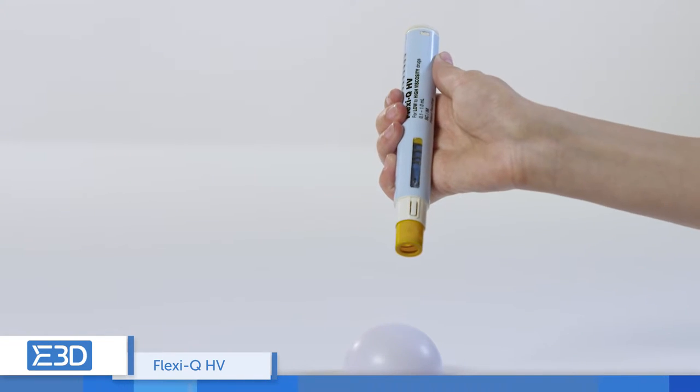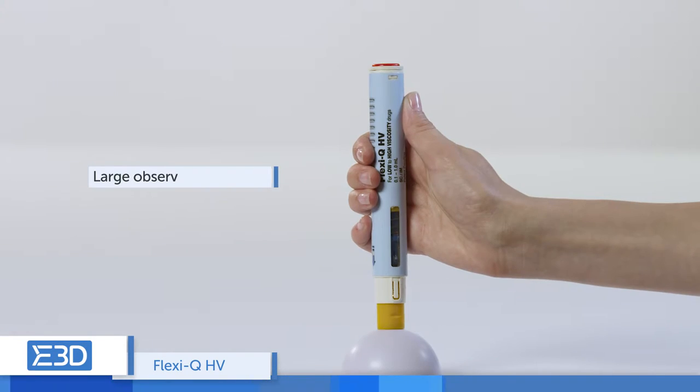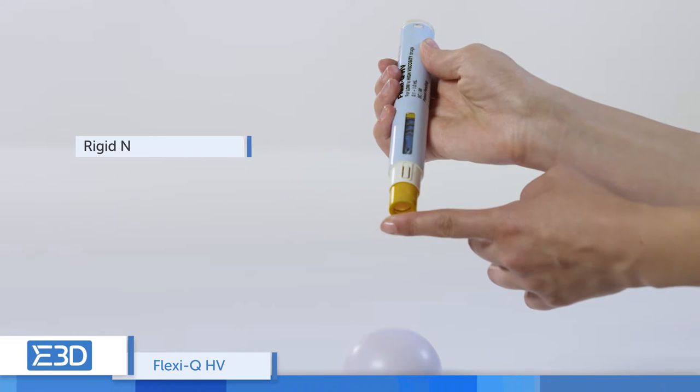The FlexiQ-HV improves patient safety and compliance with a simple inject button, a large observation window, and rigid needle shield.